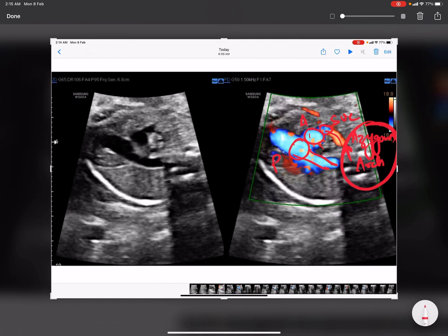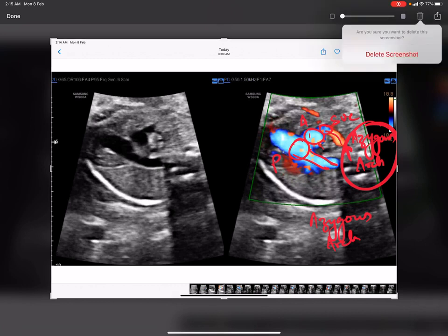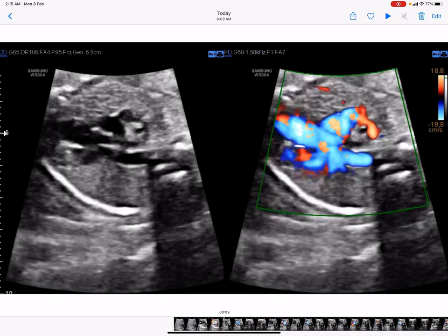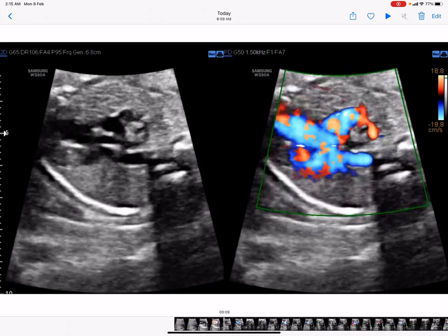My point is that don't get confused seeing an azygous arch. This is quite often seen, and this is quite often confused with an ARSA. So this is a differential of the ARSA. So I'll show you. Okay, this is the azygous arch draining into this SVC.